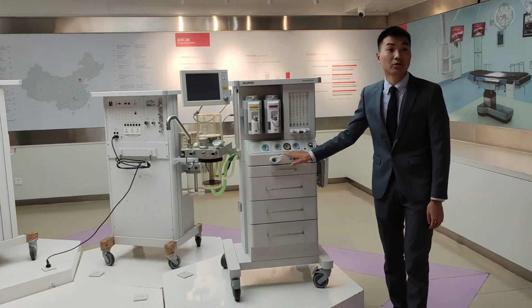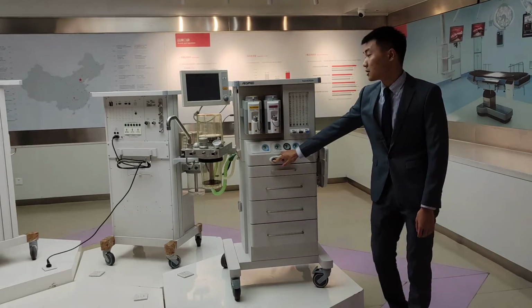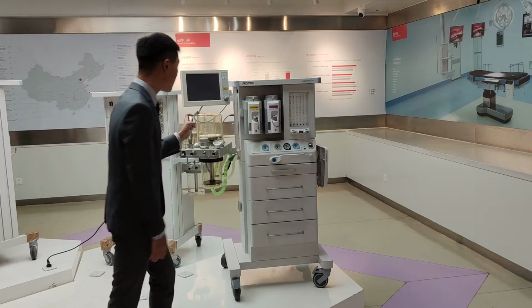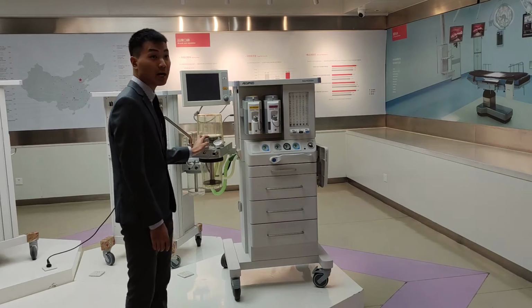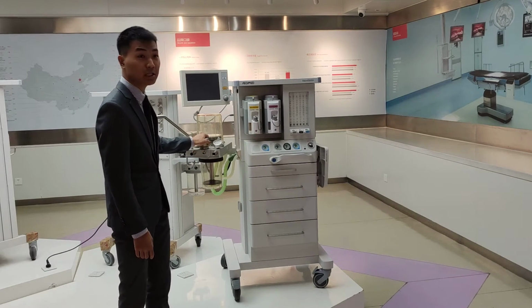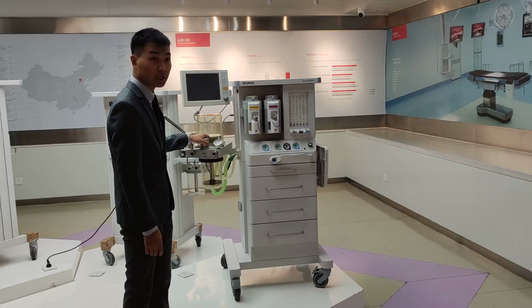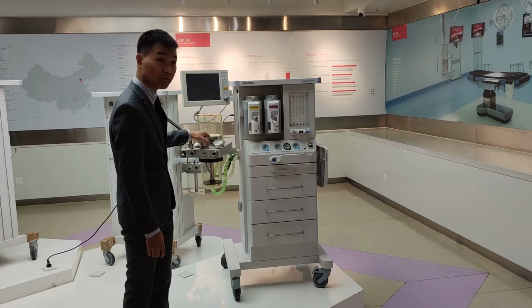Oxygen flush button to deliver oxygen to the breathing system. Breathing system: this is the APL valve. It has two functions. One is to limit the maximum airway pressure. Another is to release the airway pressure by lifting this.